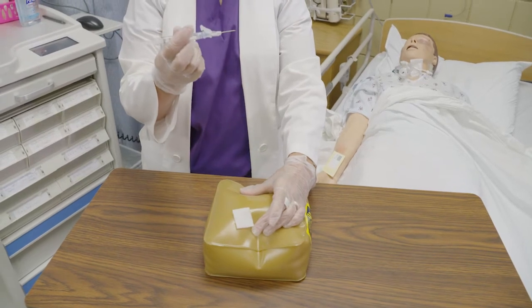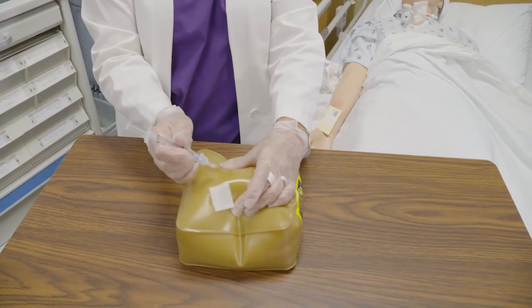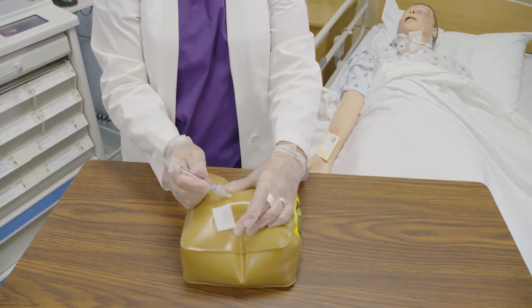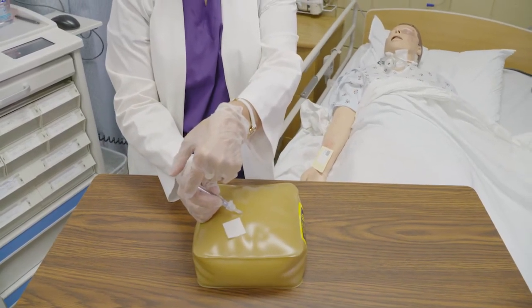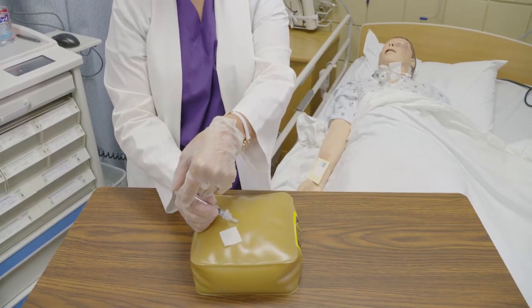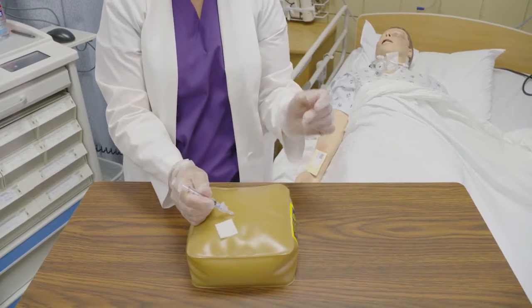Inject the needle slowly using a 45-degree bevel up. This ensures the medication is deposited into the subcutaneous layer. Let go of the pinch. Press the plunger down to inject the medication and wait 10 seconds. This allows the medication to disperse and decrease discomfort.